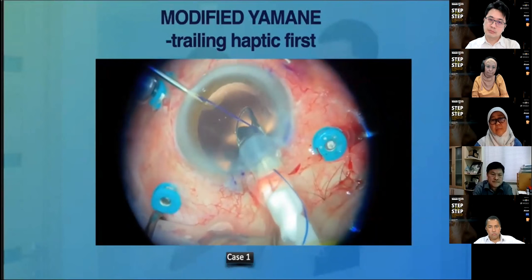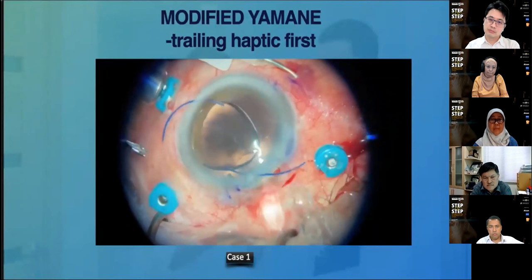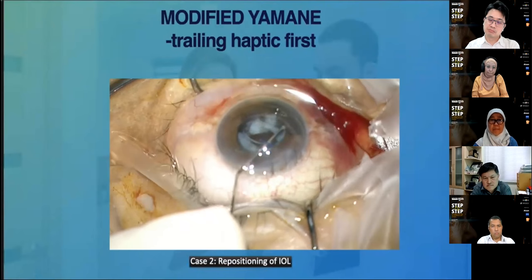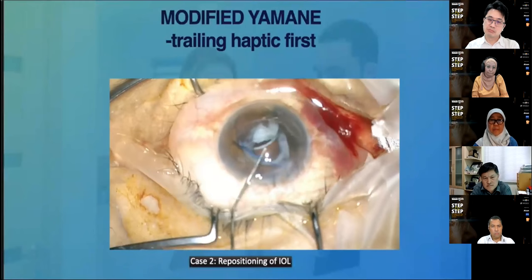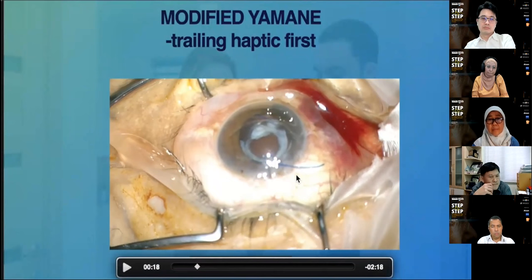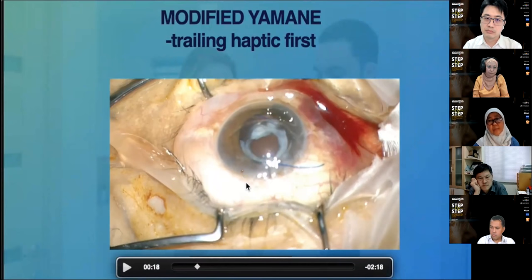Initially, I thought I would not repeat this technique in other cases because I still find the leading haptic first is much easier to do. But interestingly, recently we had a case, a complicated cataract surgery, which was one of the trainee cases. The lens was actually placed in the sulcus, but at the same time, there was a significant amount of peripheral cortex inside the remaining bag. And you can see the IOL is actually subluxated inferiorly. So we go in again, and in this particular case, we have to do two things. One is to clean up the remaining cortex, and number two is to fixate the subluxated IOL. So we decided to use the same lens, and hopefully we do not need to extend the corneal wound.